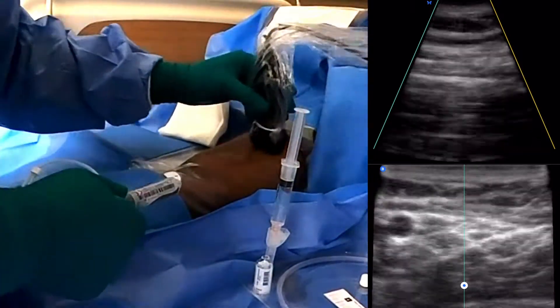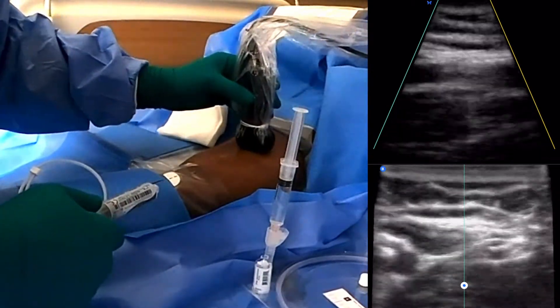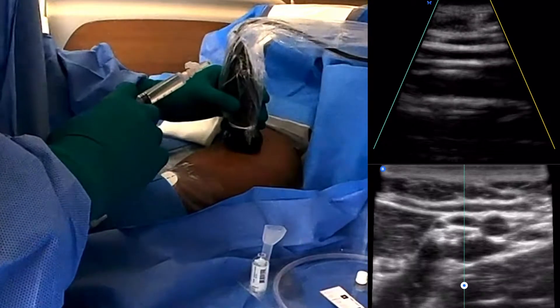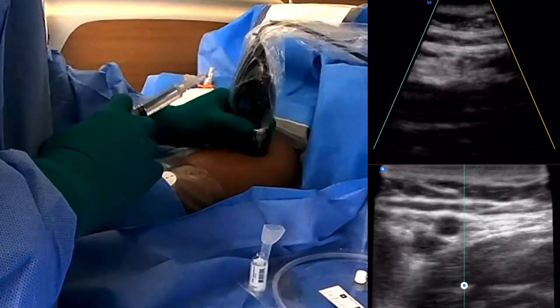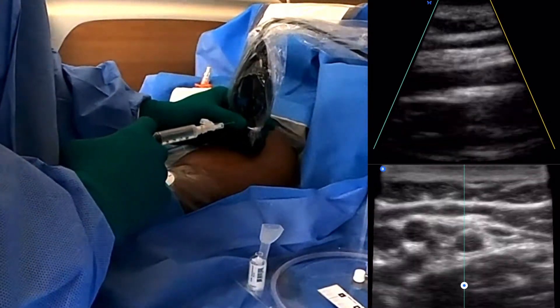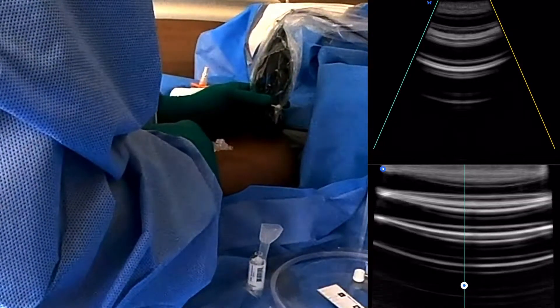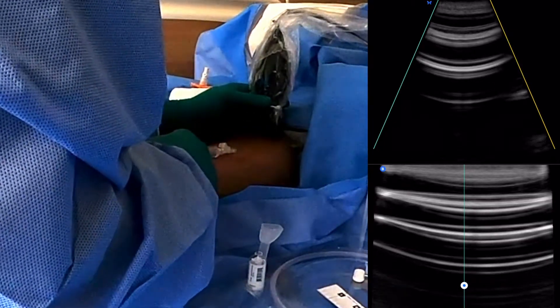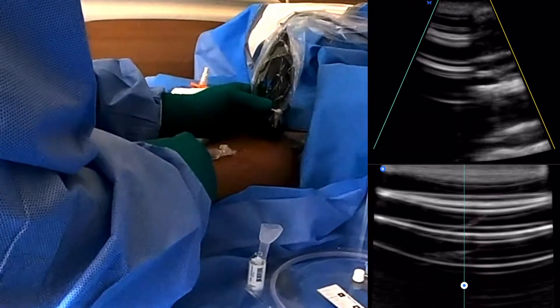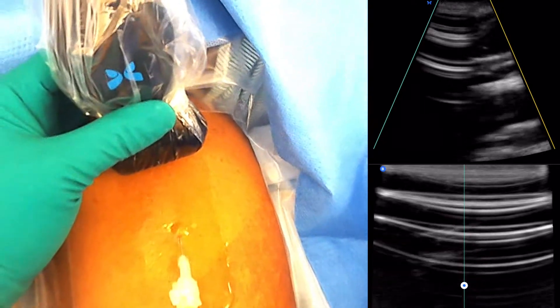Looks good. So we are going to insert it about here — I'm going to inject right there. Are you ready? Yes sir. Okay, here we go. Measure twice, cut once, as always. Ready — three, two, one. Going for that intradermal wheal. How bad was that? Do you want to turn on the lights for me? Do you guys see that intradermal wheal?